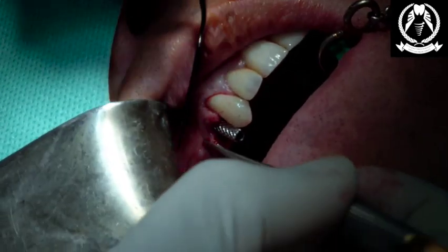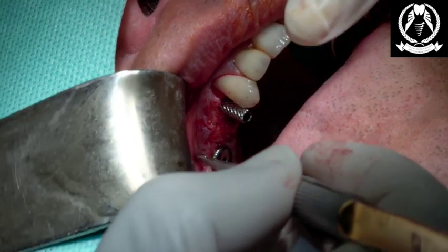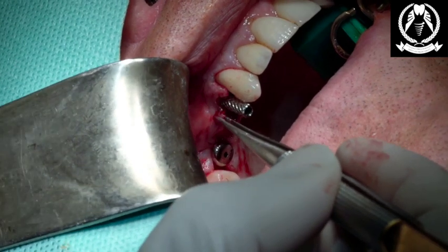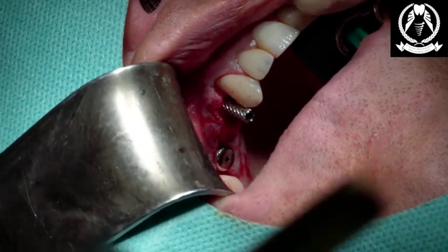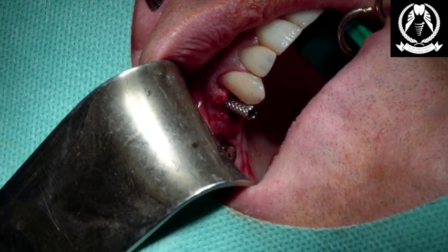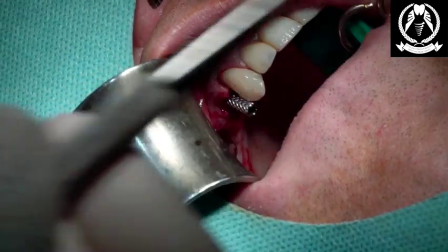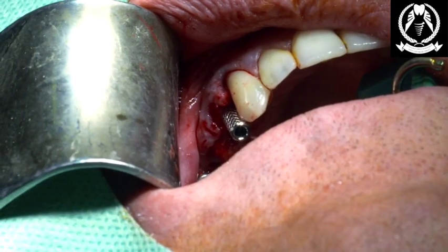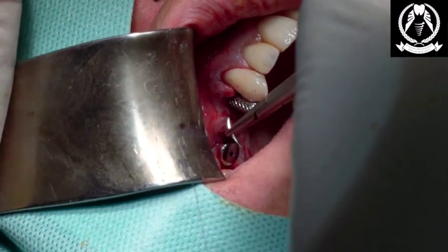Okay, so now we're just going to gently put the tissues back. You can see no relieving incisions were made, and just close things nicely here. Perma-Sharp 5-0. Right, and we're just stitching up now. Here we have a closed loop suture holder using a 5-0 Perma-Sharp. It's a nice antibacterial suture, nice and small, and we're just being gentle to the tissues, bringing them back in.